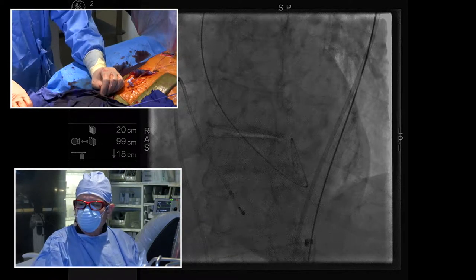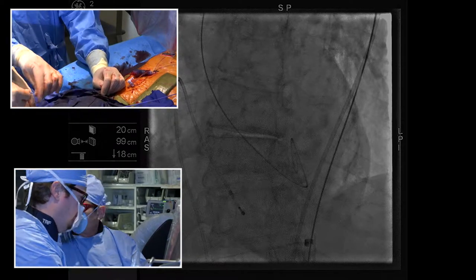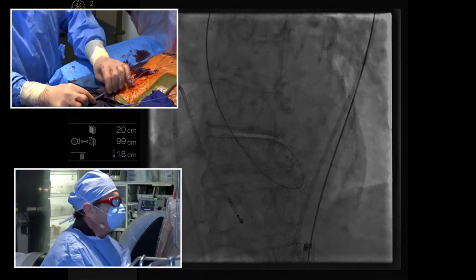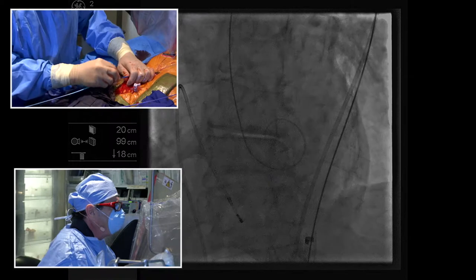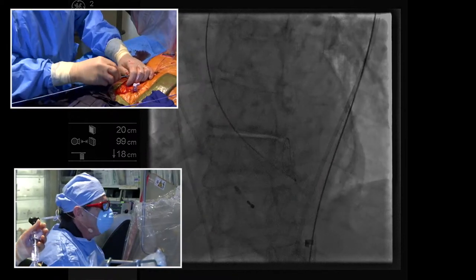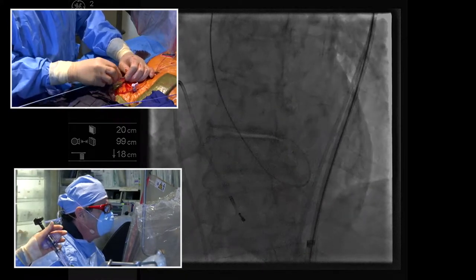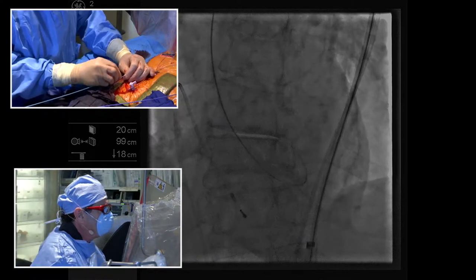It's a little short. It should be a little longer, but I get it that I'd rather have the Edwards engineers working on new valve technology than balloon technology. And you have to pace with it. There's a balloon made now that has a TrueFlow that we like better because it lets blood flow through it while the balloon is expanded. We don't have to do pacing. But let's see if this goes through.